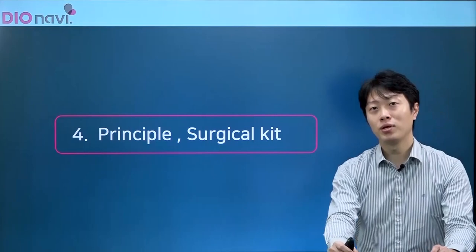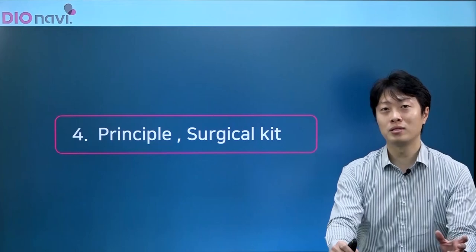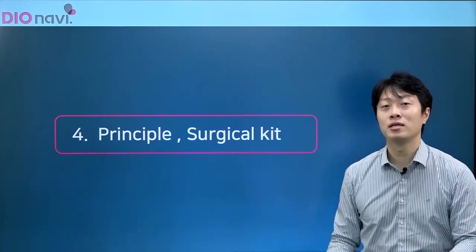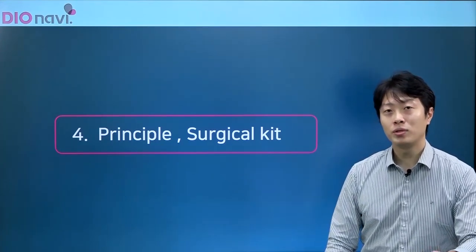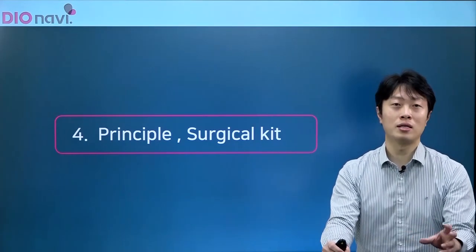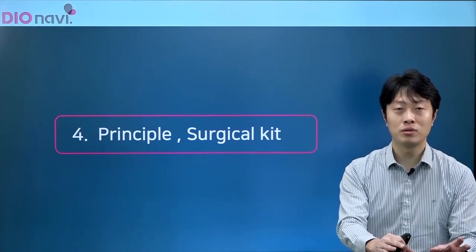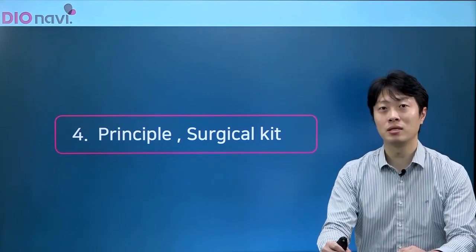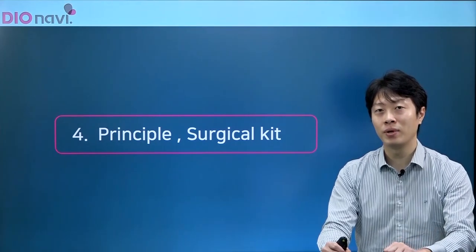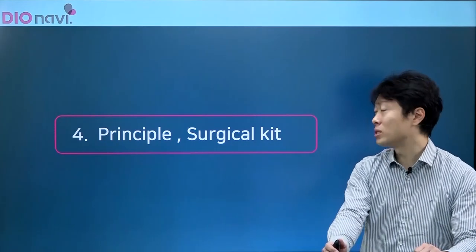Thus far, we have looked at how to produce accurate surgical guides. We saw how to obtain precise data and produce precise surgical guides. The DIOnavi surgery relies on surgical guides, so accurate production of the surgical guide is extremely important. So please be sure to check every step of the way whether the preceding process has been carried out correctly. If you check, produce accurate guides, and perform surgery with them, you will be able to operate more accurately and completely.